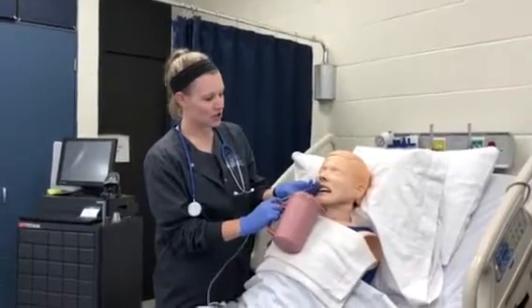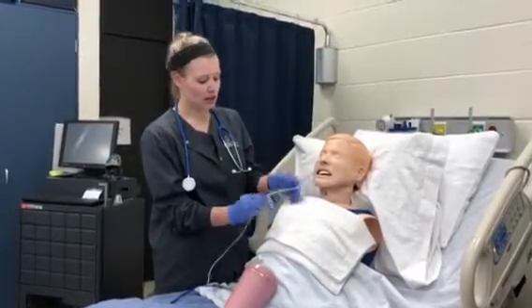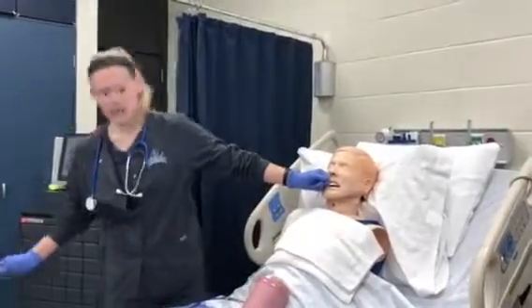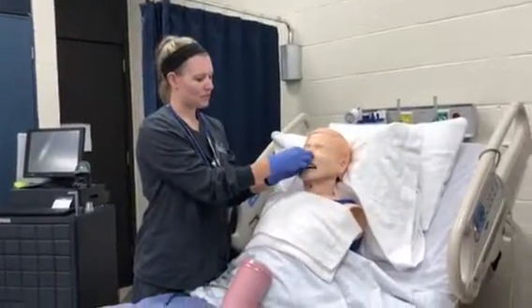sip. And just due to this mannequin not having a very good lubrication system, it's not going to go in all the way, but we're going to say that we're to our 52 mark. So I'm going to hold it there, and I'm going to temporarily tape it because I don't want to permanently tape it yet, just because I don't know that we're necessarily in the right place yet. So there's our temporary tape to hold in place.